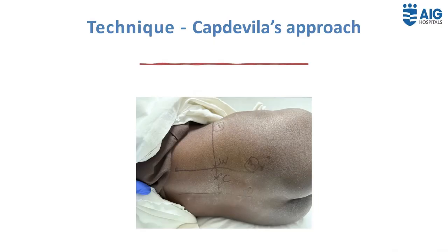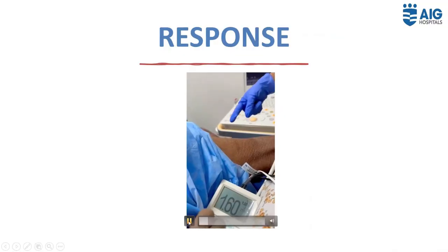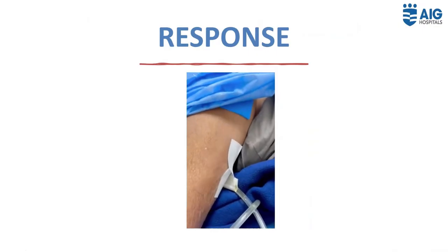The needle contacts the transverse process at 6 to 8 centimeter depth. This depth is noted, the needle is withdrawn and reinserted by directing it 5 degrees cranially or caudally to pass its tip beyond the transverse process until the evoked motor response or patellar twitch is obtained. The needle should not be advanced more than 2 centimeters beyond the transverse process. This is the desired response, which is the quadriceps twitch upon stimulating the lumbar plexus in the substance of psoas major.